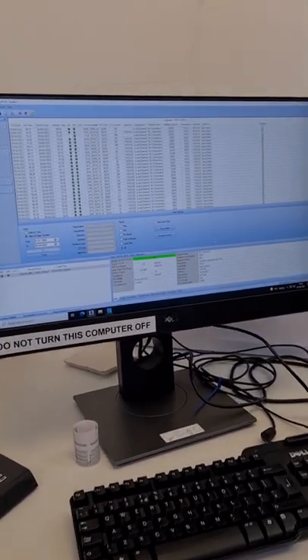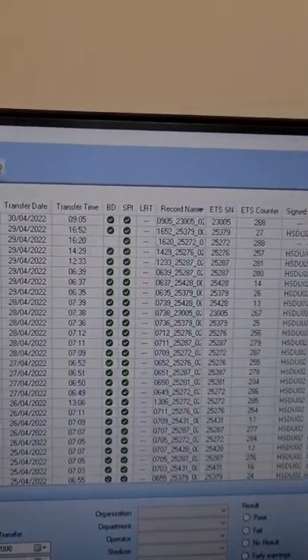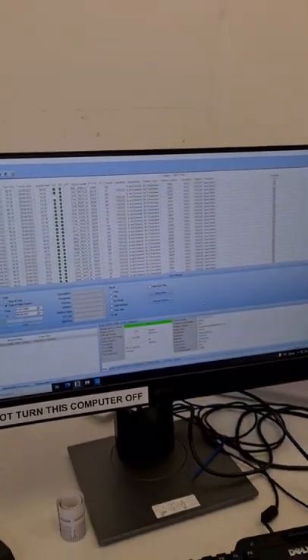That shows the result of the downloading. It has downloaded successfully and the autoclave is ready for use.